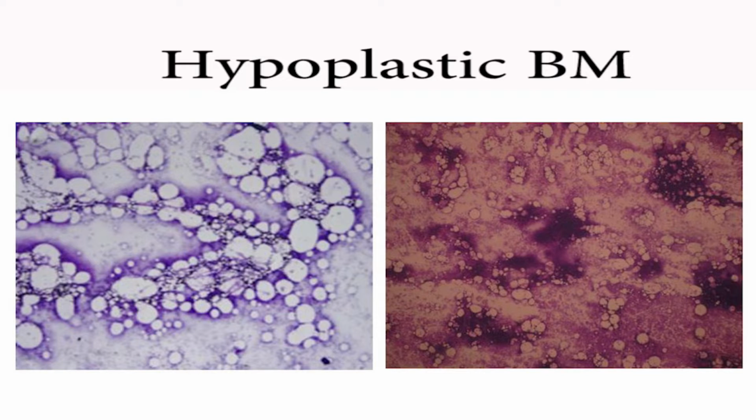This is what is seen in aplastic anemia. Mostly you are fortunate if you get such fatty fragments in aplastic anemia. Mostly you don't get anything. That is my experience. But if you get such fatty fragments, yes, they are hypocellular.